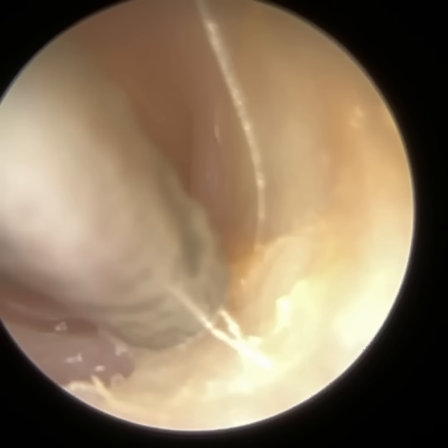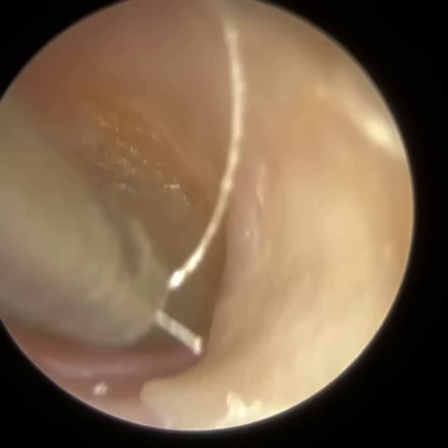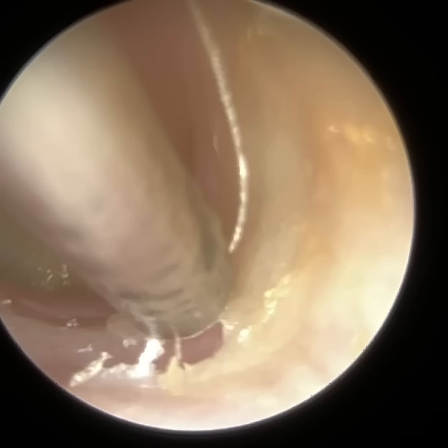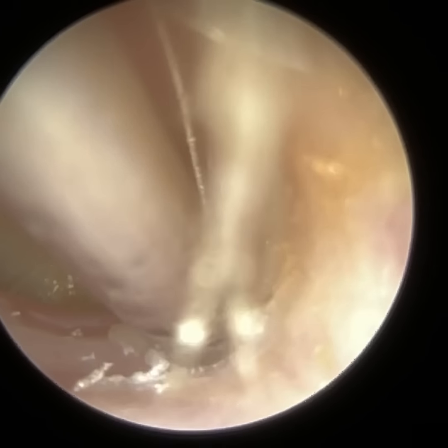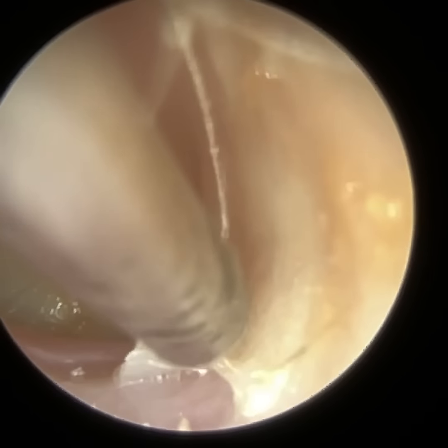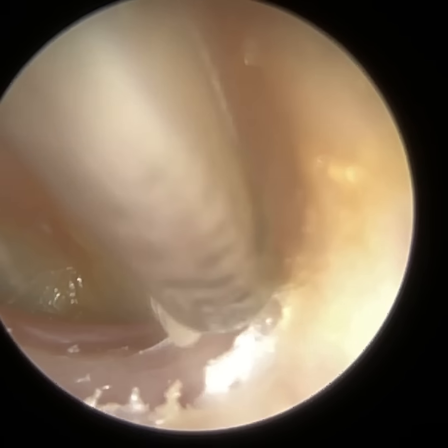Now, sometimes when you perform microsuction, microsuction reduces the ear temperature, and the organ of balance. So in the inner ear, we've got the cochlea, the organ of hearing, and we've got the organ of balance. We call that the vestibular system. And the vestibular system consists of 3 semicircular canals at different orientations. You've got one semicircular canal which travels upwards, so we call that the superior canal.